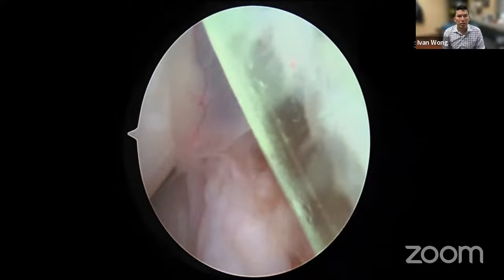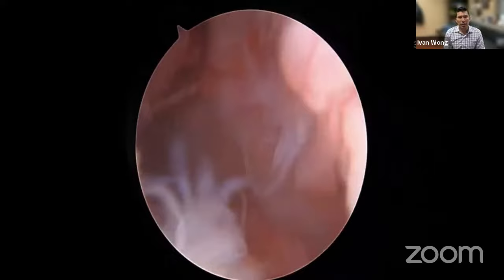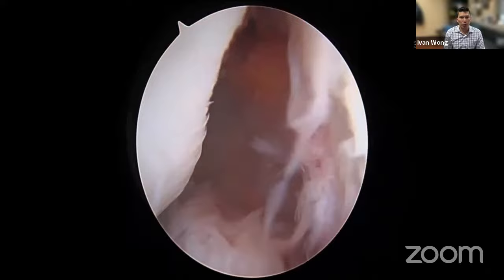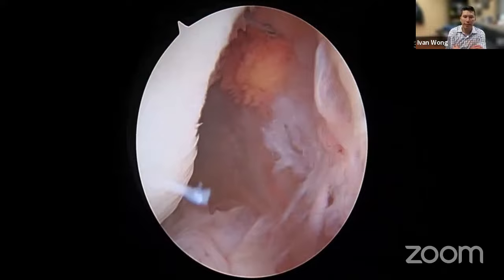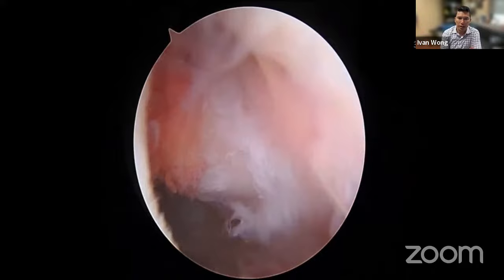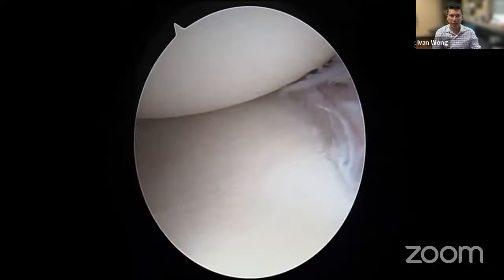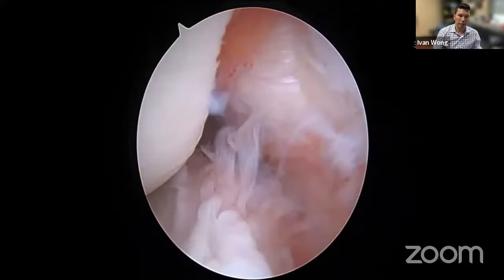Moving the camera posteriorly, you can see the two suture limbs from the two percutaneous anchors placed in the Hill-Sachs lesion. There is still a cannula through the deltoid and the bursal surface from where we placed those anchors. All we have to do now is tie them back together outside the cannula — tying the remplissage ties the capsule back onto the humeral head, decreasing that space so the Hill-Sachs cannot engage. Our final view shows the shoulder back in socket in a neutral position.